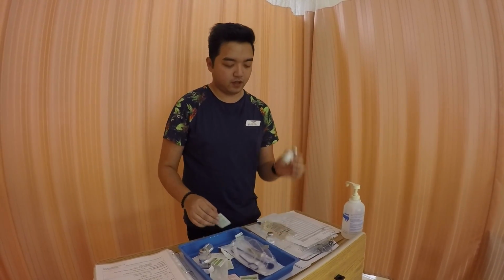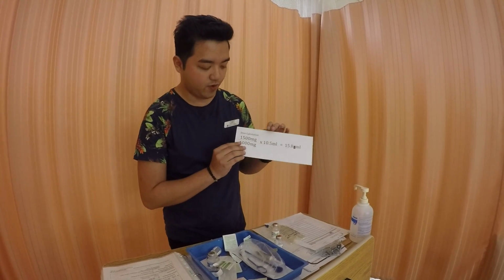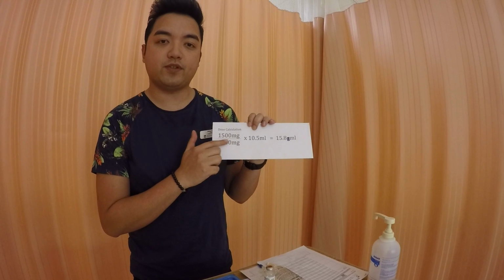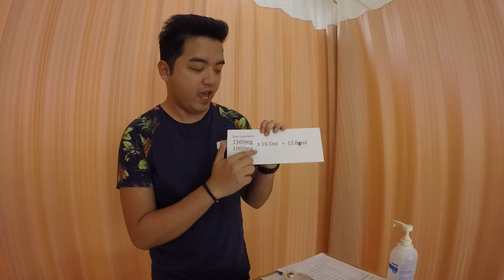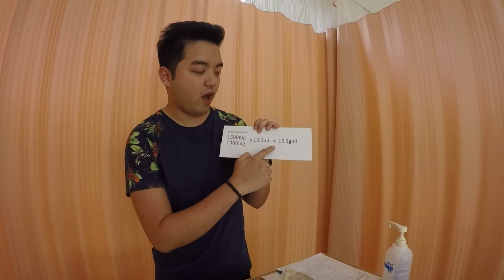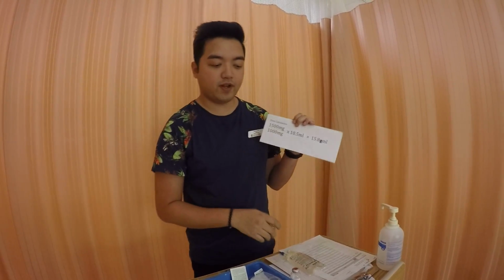So first, to get the ml for the computation. So my doctor's order is 1,500 milligrams. So I just divided that by 1,000 mg, which is the stock dose, times the final volume of the one in the vial, which is 10.5 ml. So I will be getting 15.8 ml to get the 1,500 milligram dose.